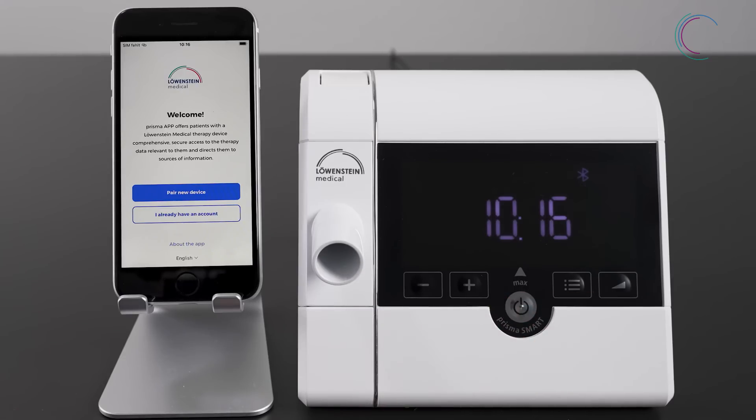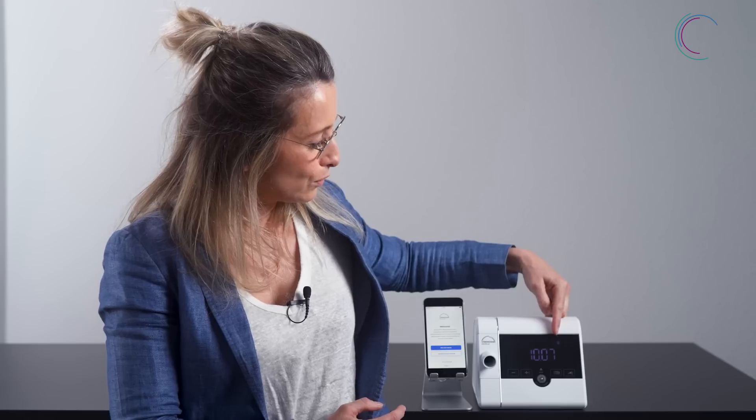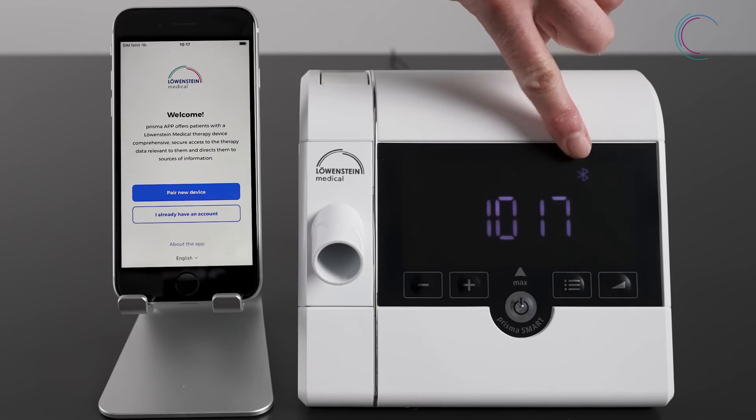Go back to your home screen. To pair the therapy device, make sure that Bluetooth is activated. Bluetooth is active when you see the Bluetooth symbol in the upper right of the display.